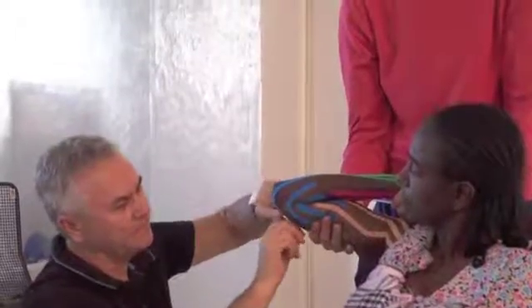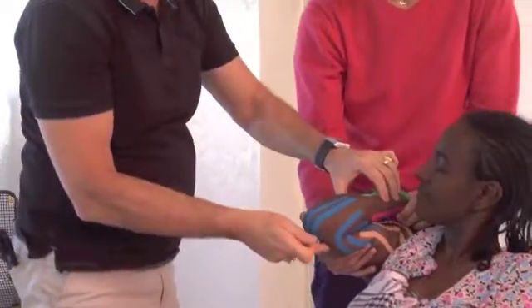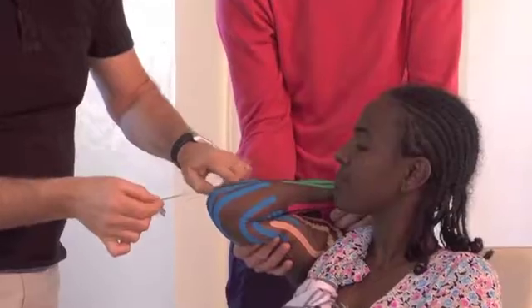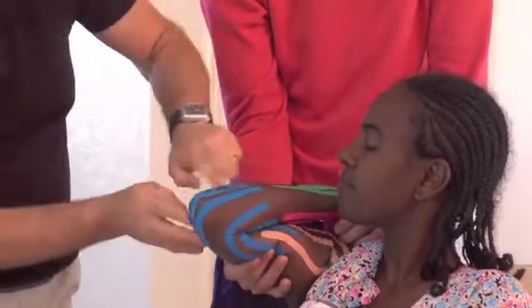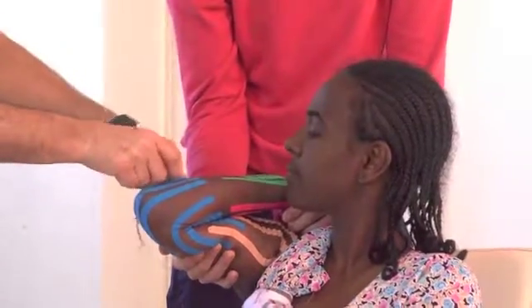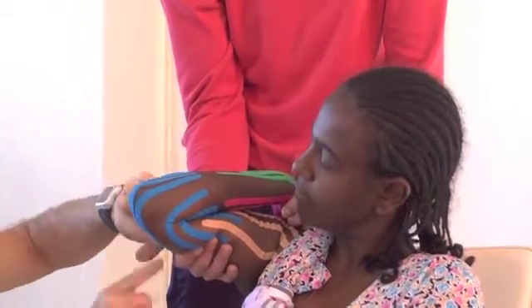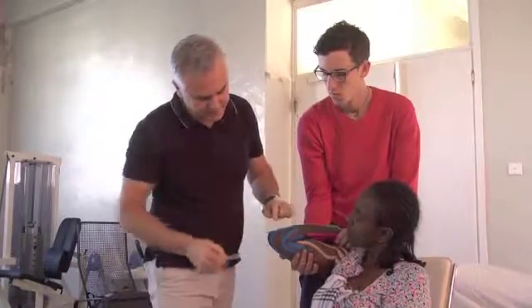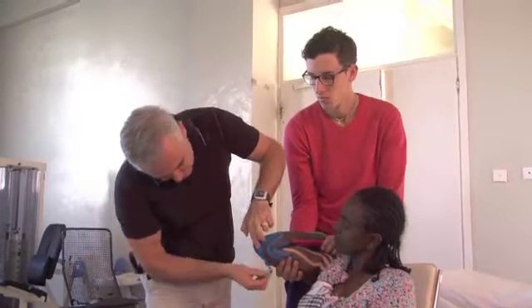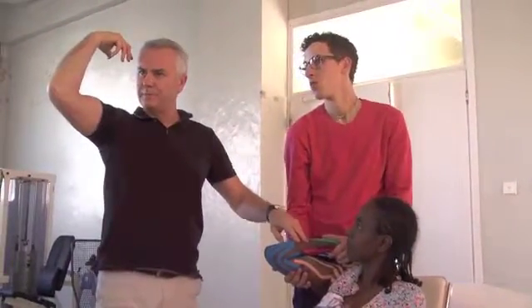Do not stretch the tape. Take off the paper, don't stretch, lay it down. Don't cover one strip over another — they are going to be separate. The skin needs to be stretched. If you apply the tape where the skin is not stretched, it is going to be compression. So you have to apply the tape where the skin is stretched. If she has limited flexion — do you stretch the tape or stretch the skin?